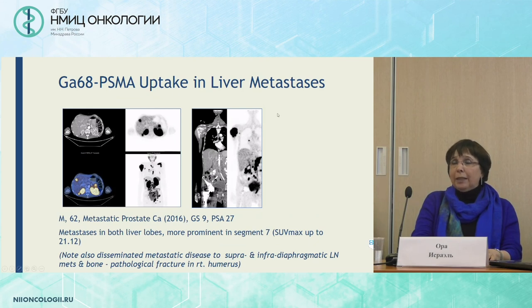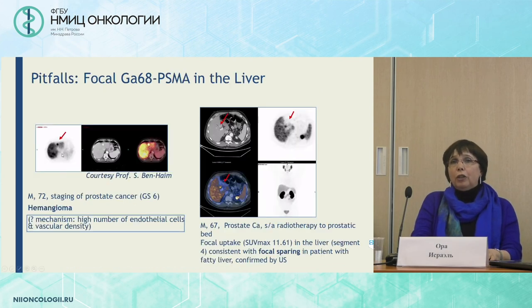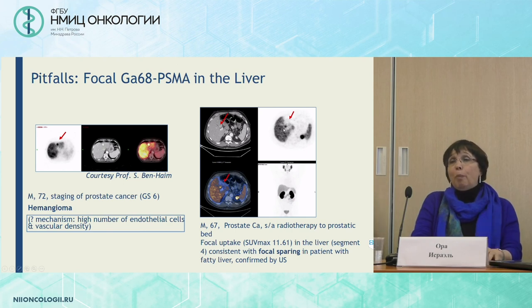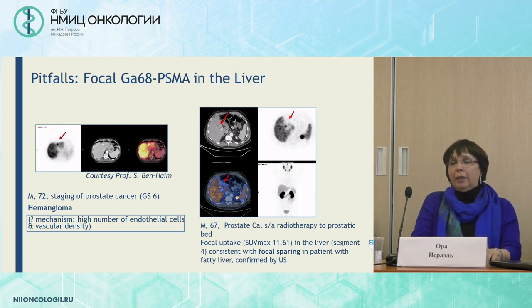Uptake of PSMA in liver metastasis — one of the visceral sites where prostate cancer can metastasize — as seen in this patient. But we can also see PSMA uptake in liver hemangioma, as in this patient, or in a case where there is actually no pathology in the liver but there is fatty liver, with sparing of liver tissue only in a small segment of normal liver tissue, which appeared relatively increased in almost one liver segment.